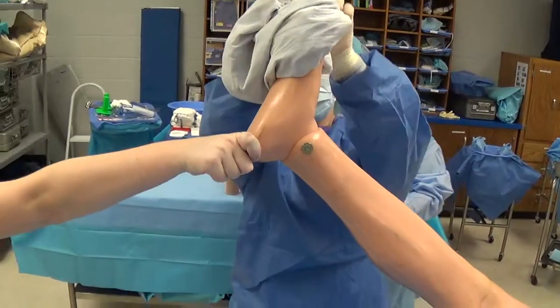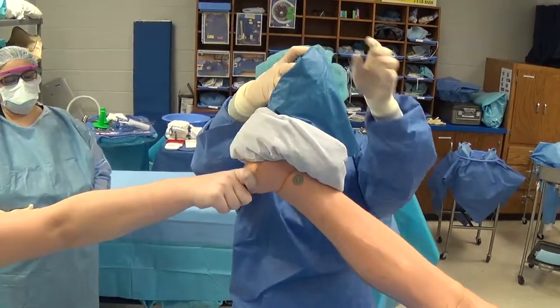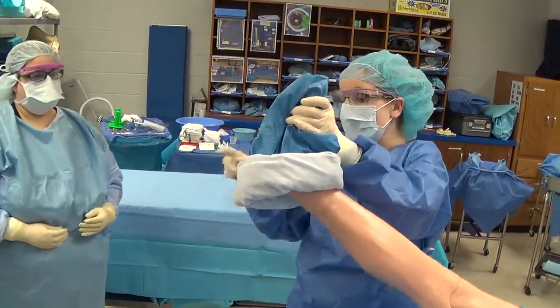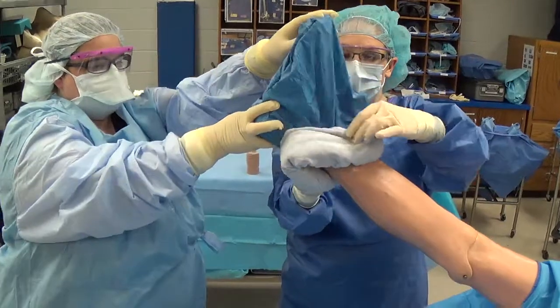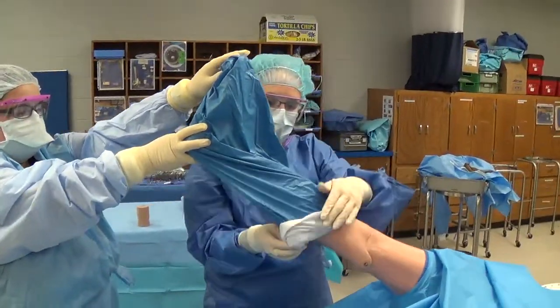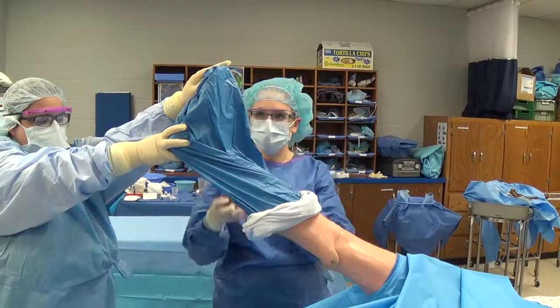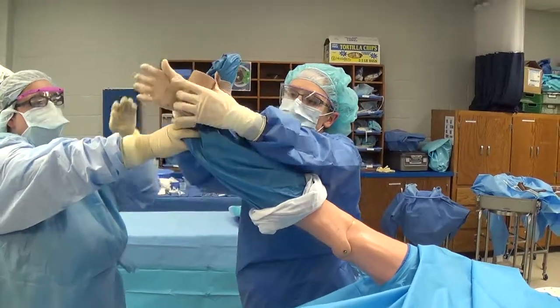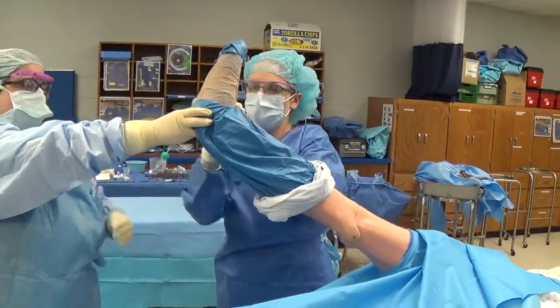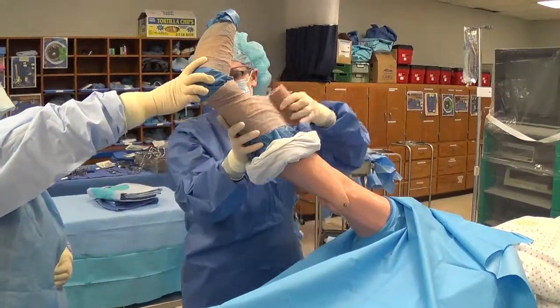You need to communicate with the person holding the foot so that we don't accidentally drop the patient's leg. Another sterile person will hold onto that foot so that it can then be secured with a co-band in order to hold the impervious stockinette in place. You may have a surgeon that uses an ace bandage, but most commonly we utilize a co-band to wrap the entire stockinette and secure it to the patient's leg.